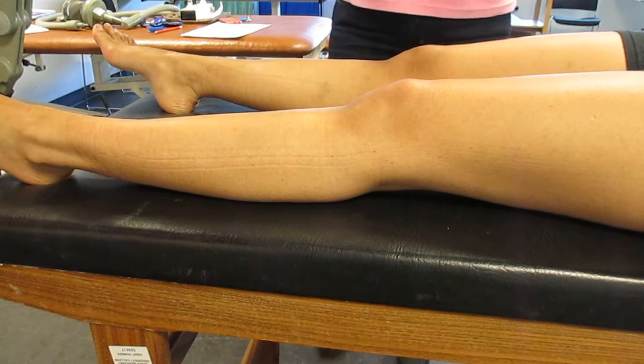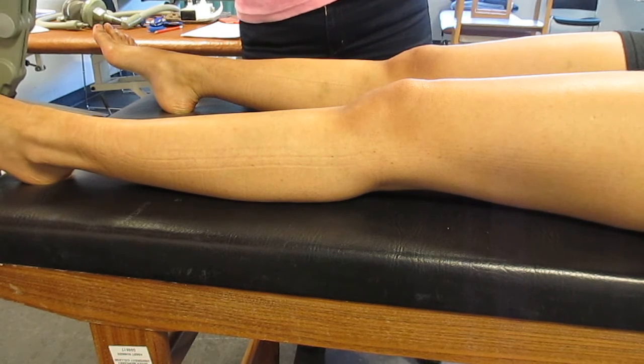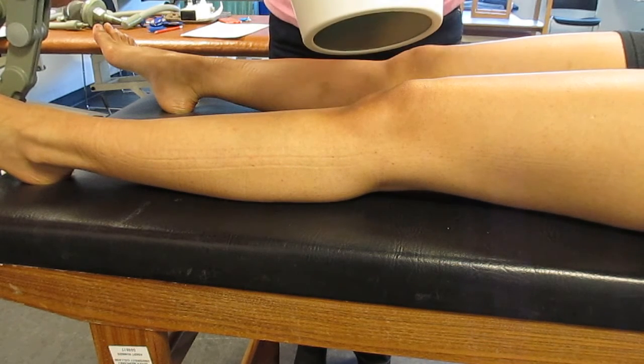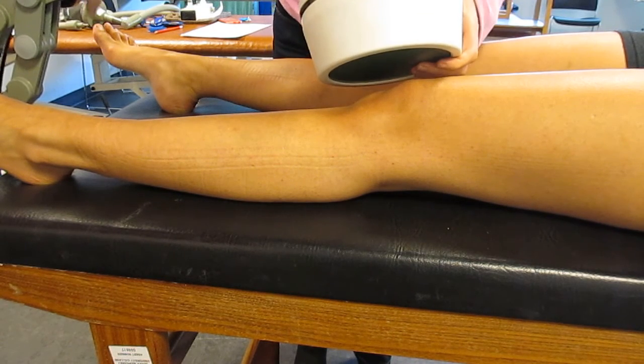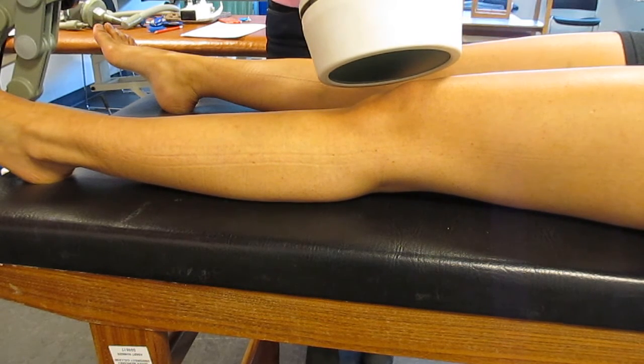I've then got the machine set up at the end of the bed. I'm going to use the circuplode for this, and I'm going to assume that my patient has got an acute bursitis around her knee. If you're using the circuplode, you need to get it between 2.5 and 5 centimetres from the skin, and that's about right there. So my patient's comfortable, she's ready to go.